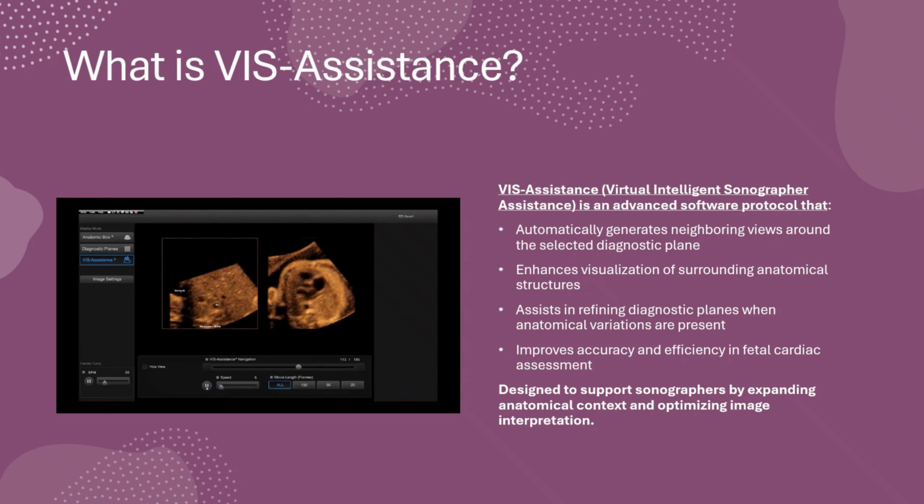It's also incredibly useful when the initial diagnostic plane shows anatomical variations or isn't optimally aligned. In those cases, this assistance helps refine and improve the image, giving you a more accurate and comprehensive evaluation, all with greater speed and consistency.